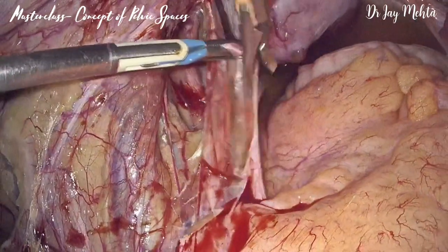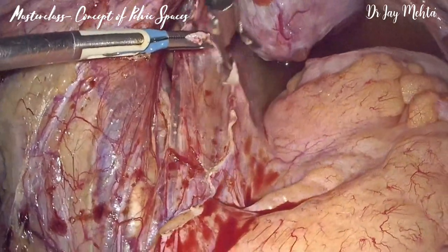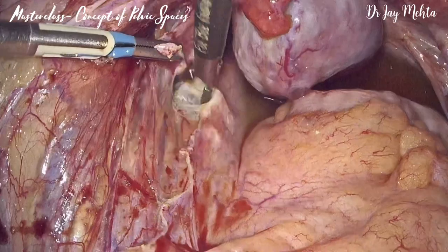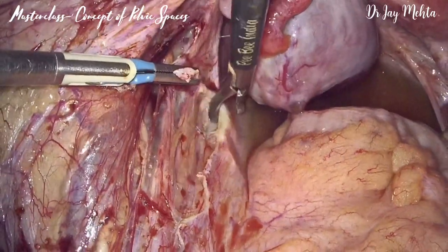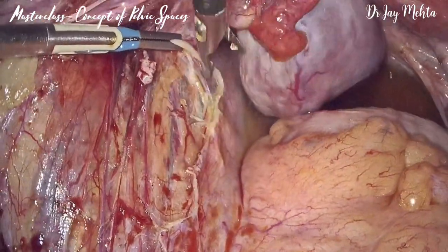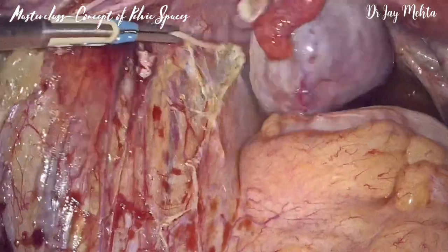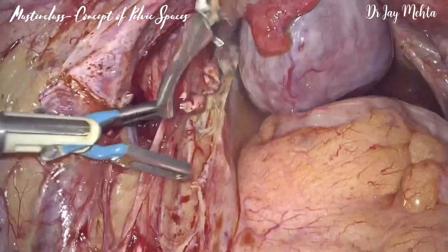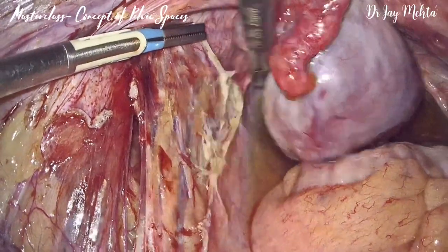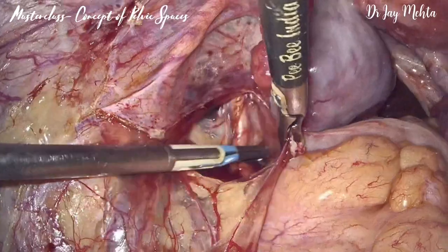Here we are demonstrating the dissection and opening of the pararectal space medial to the ureter. This part of the pararectal space, especially the space which opens up close to the uterosacral ligament, has multiple names — you can call it Latsko space or Okabayashi space. But for practical purposes in routine surgery, remember everything as the pararectal space. The structure which divides the pararectal space into two parts is the ureter.